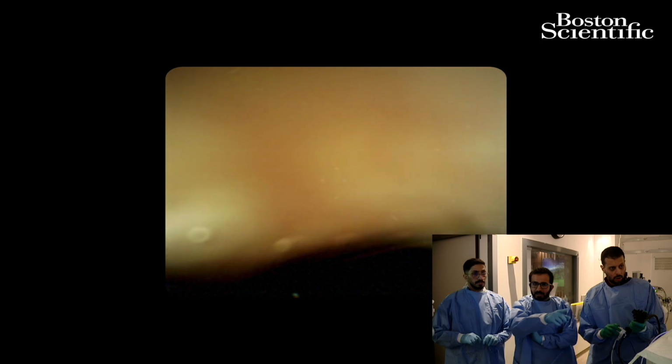Good. So can we switch? As you can see, I'm inside the bile duct now. Can you guys see the SPY picture? Good. So in the fluoroscopy, the stone is actually bigger than the shaft diameter. So it's actually around a 2 centimeter elongated stone.